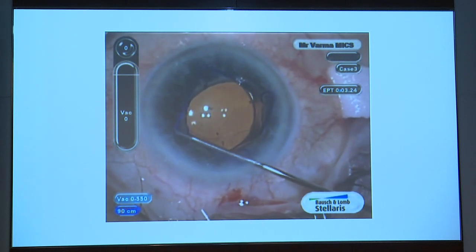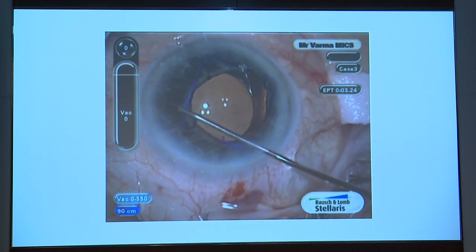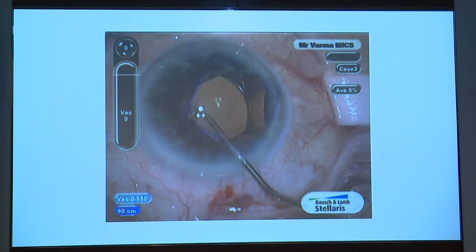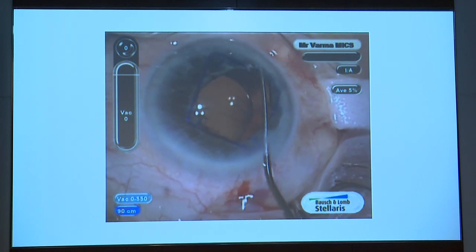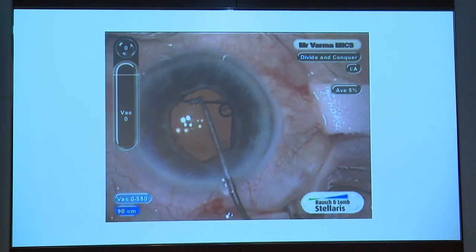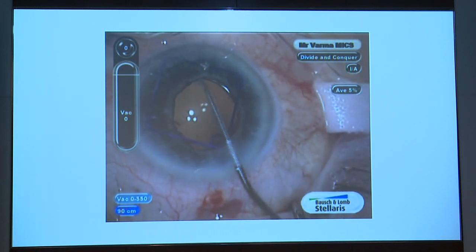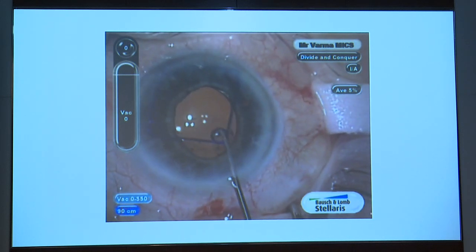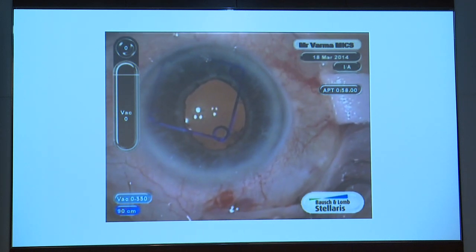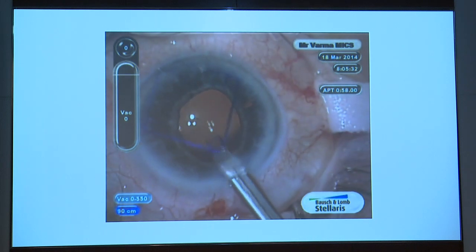Harshul, this is for you. So very atrophic iris. He is trying to dislodge the Malugins ring, and sometimes it tends to trap the iris tissue, and especially it can get wrangled on it, and 99% of the times it doesn't matter. But now he's got 3 rings off, the 3 twirls off, and then he decides that he got the 4th one. He manages to now use the injector to remove this.